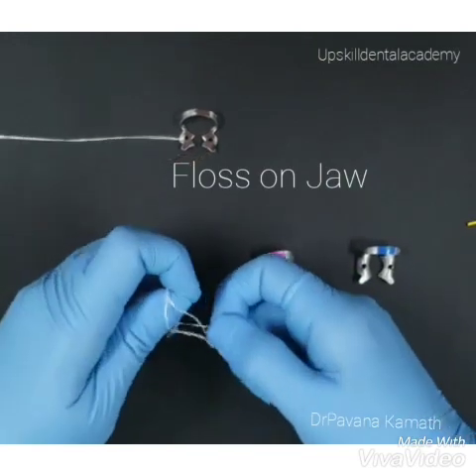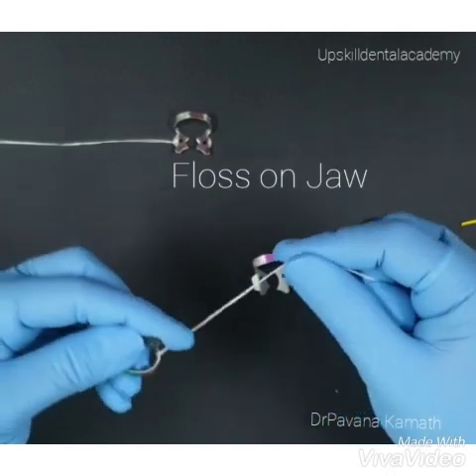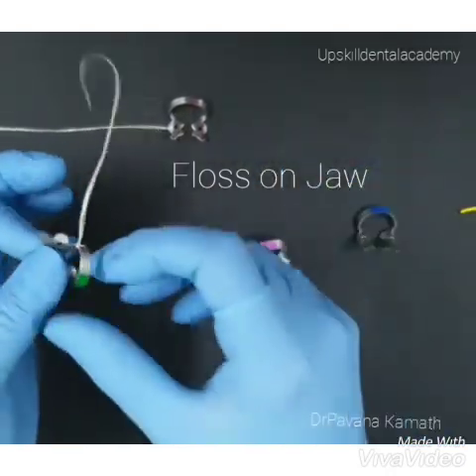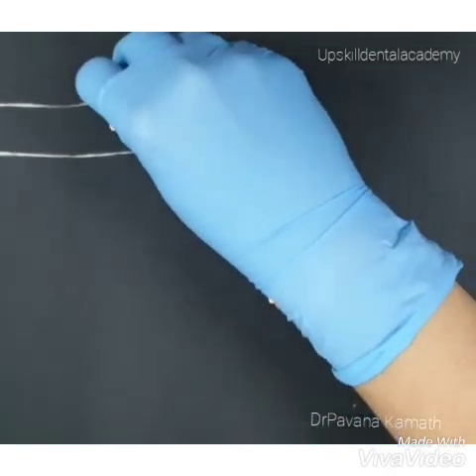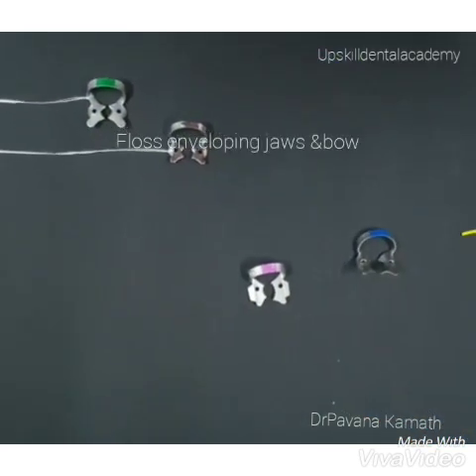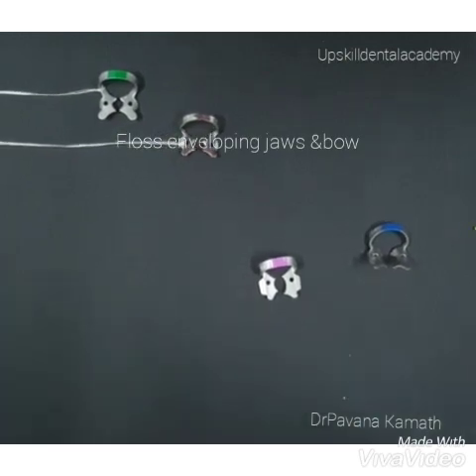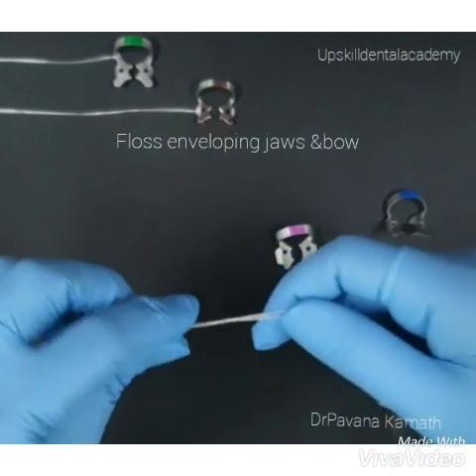The free end of the floss would be taken buccally, extraorally, and placed outside. It helps to tie the free end of the floss to the Rubberdam frame. The other two methods would show how to envelop the floss around the jaws and the bow.